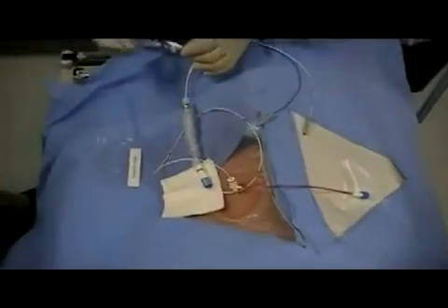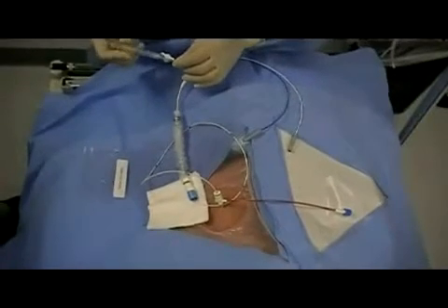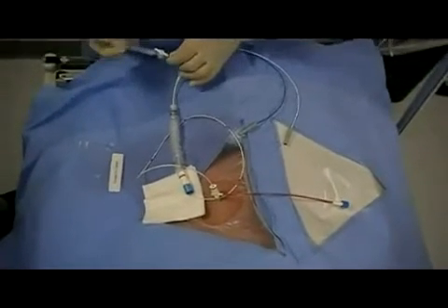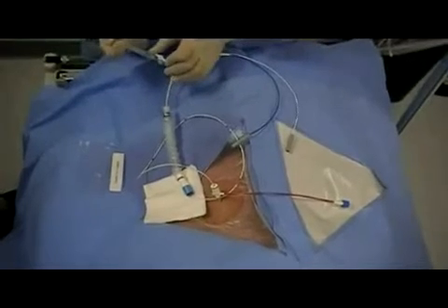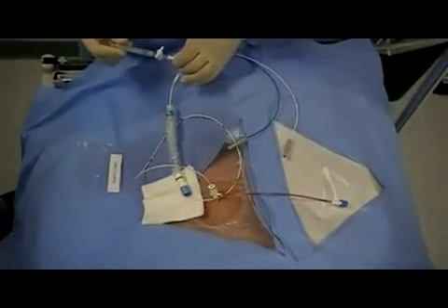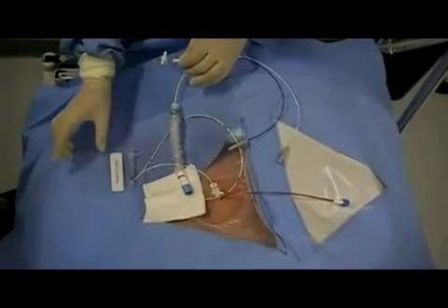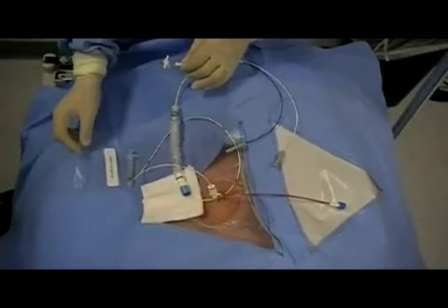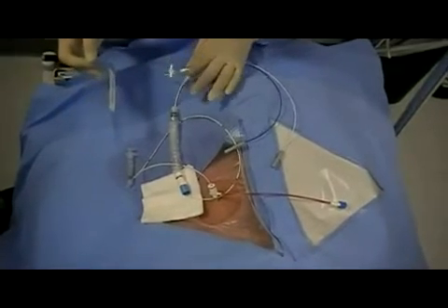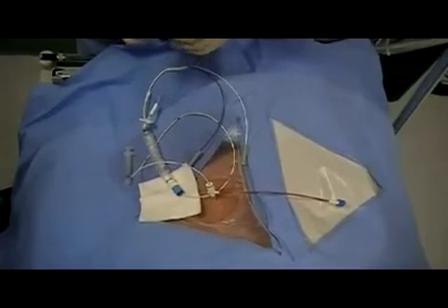It is important to insert the catheter wire to at least the 20 cm mark prior to inflation to ensure that the distal end of the wire and its balloon has passed through the entire length of the cordis catheter. The valve must be turned to the locked position to maintain balloon inflation. The balloon allows the wire to float gently into place and reduce the likelihood of intimal damage.